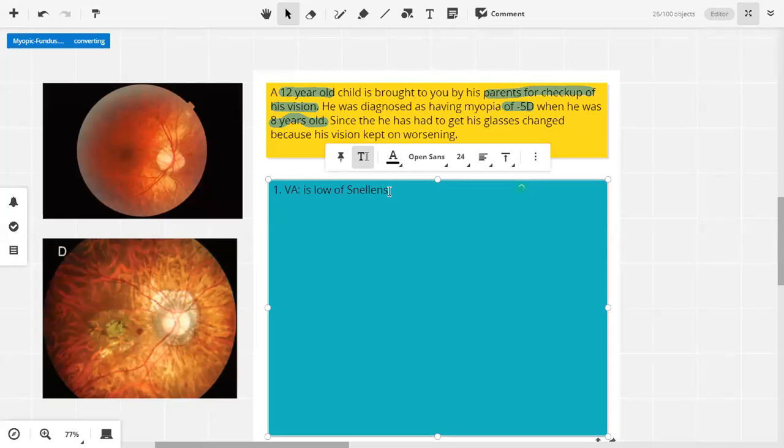चलो अच्छा, what else can we do to check the visual acuity? Photorefractor, right? What else can we do to check the visual acuity? Retinoscopy. Do you know what happens in myopia? If you've seen the video, you know how the retinoscopy will appear. किस तरह से examination नजर आएगा.